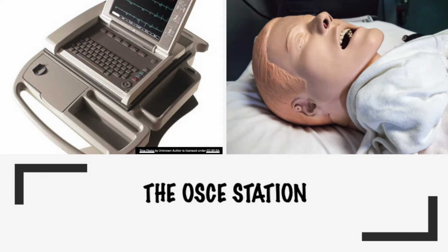In a typical OSCE station, you will be given a scenario like this. Mr. Smith presents with shortness of breath and chest pain. Please take an ECG and present your findings. You will demonstrate placing the ECG leads on the mannequin, and then the examiner usually gives you an ECG to look at and describe the findings. We will cover how to do this next.